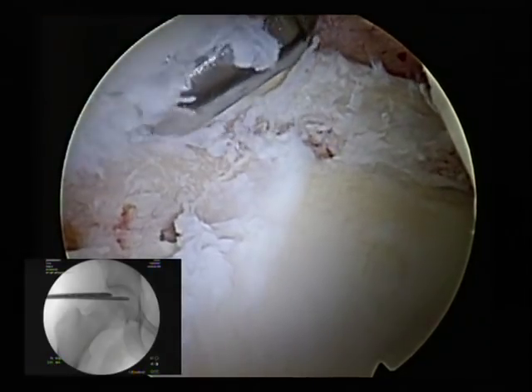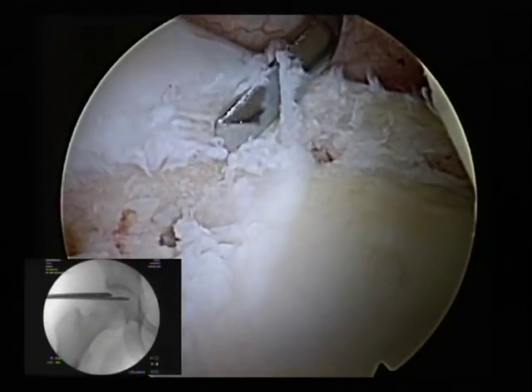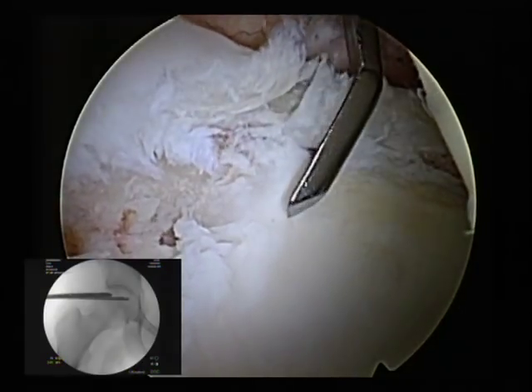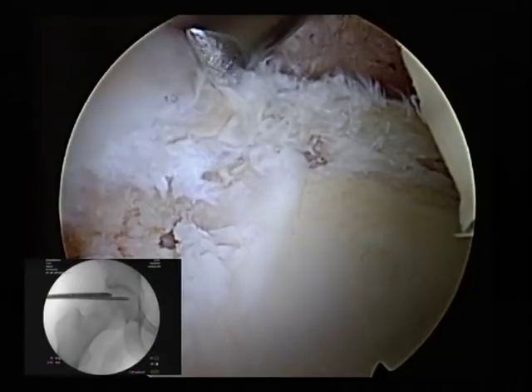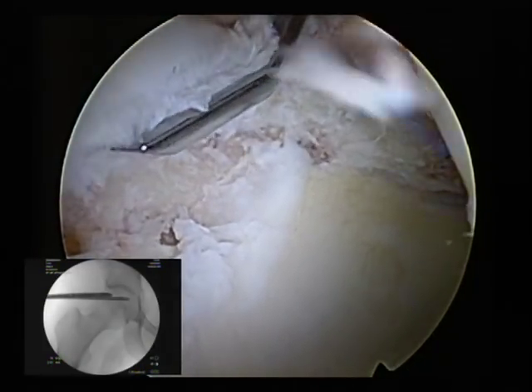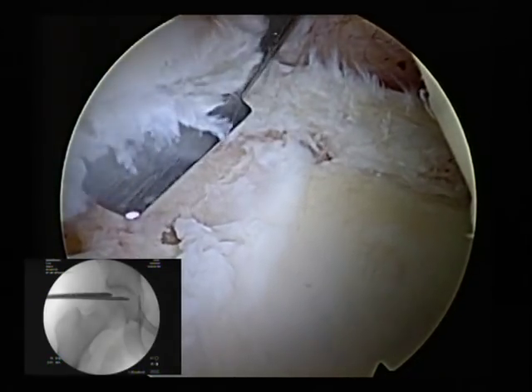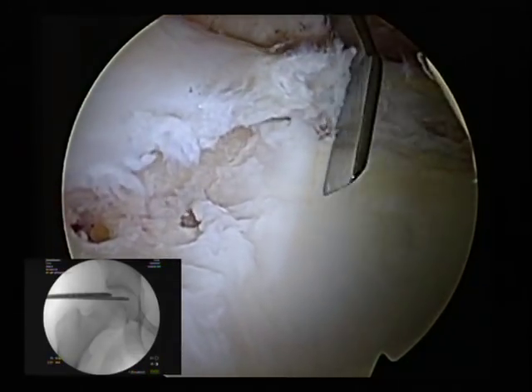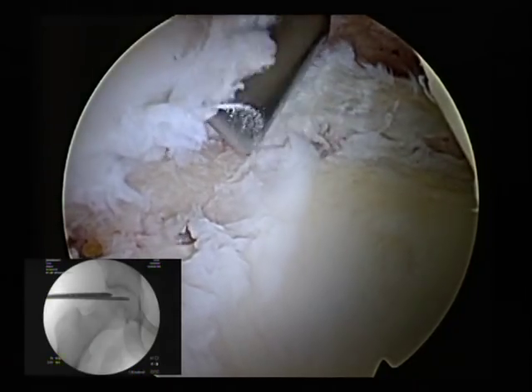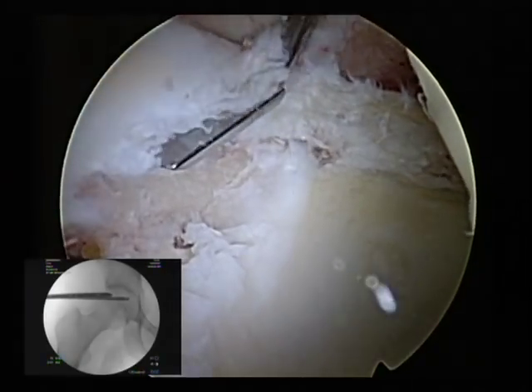This is fairly degenerative tissue here. I'm kind of really slipping into it very effortlessly. I think if it comes off that easily, you should probably detach it anyway and give it a good stable rim. So we'll try to preserve that, put our circumferential stitch roughly in this area. The idea is to preserve the circumferential fibers as much as possible. If you leave this tissue without fixing it, it's going to potentially catch again. So we're going to put the anchor here and bring the tissue back away from the joint and still maintain some of that labral seal effect.